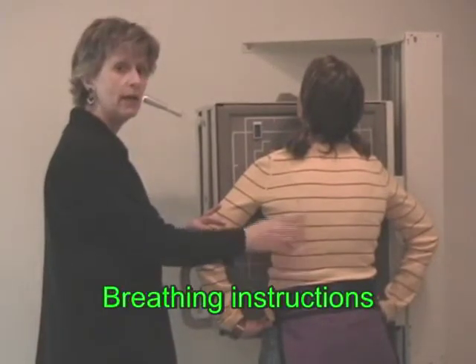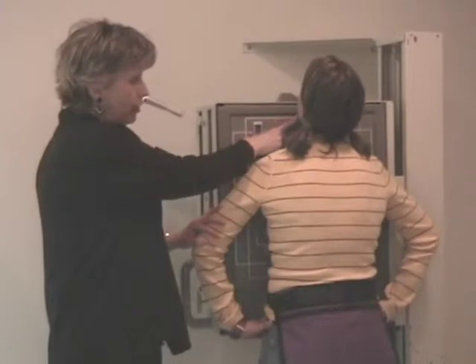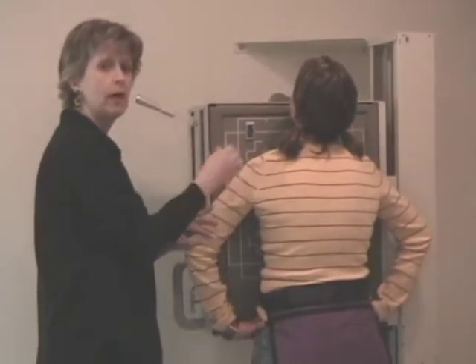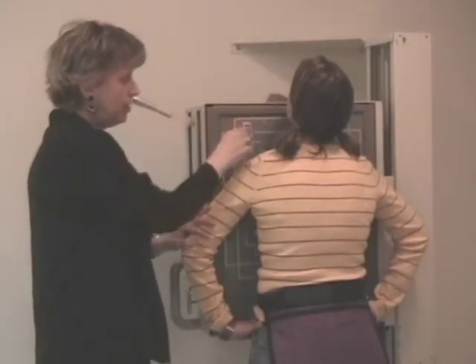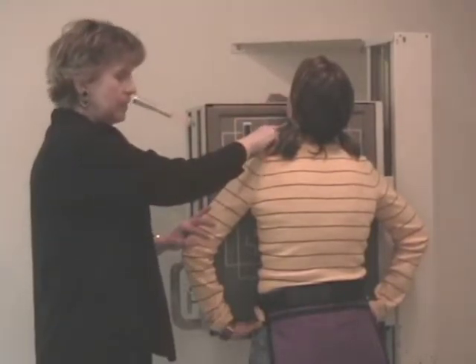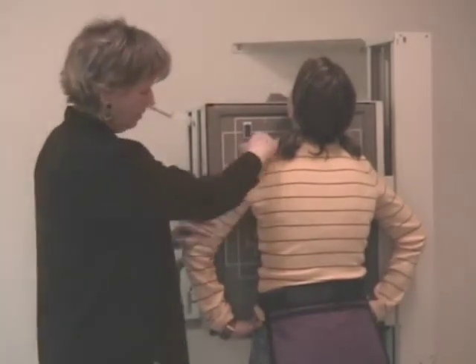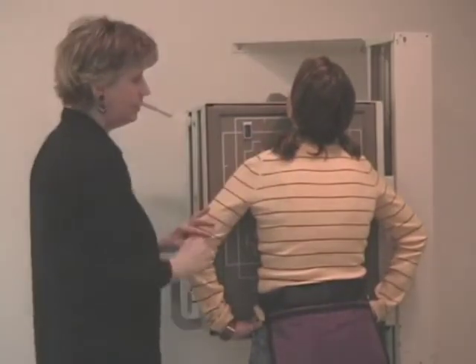Before I do that, I will show you here. Her chin is not all the way up on the chest board. That's okay. A lot of patients, it will be up on the unit here, but sometimes you just elevate the chin and lean the patient in, because we want that 2 inches clearance there.